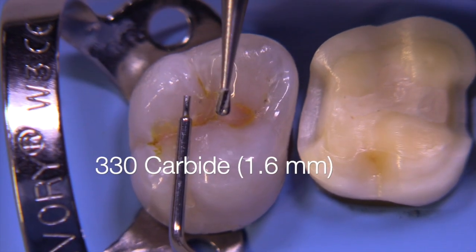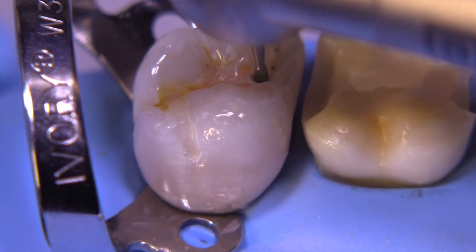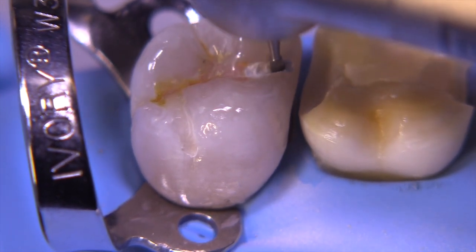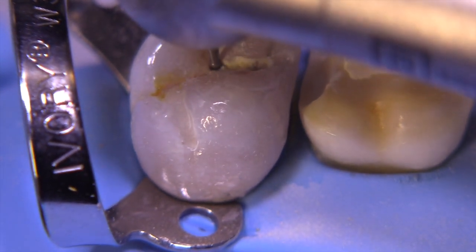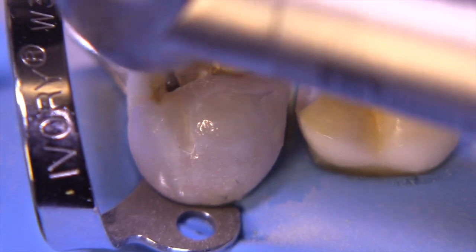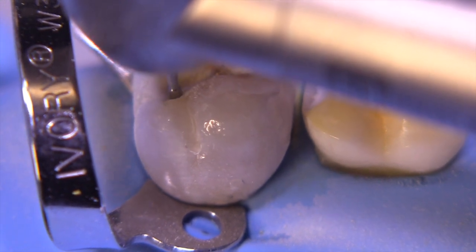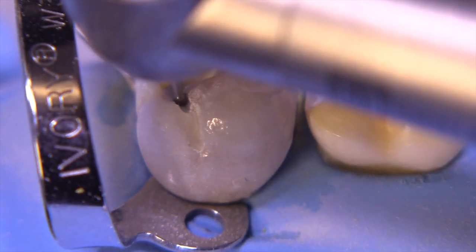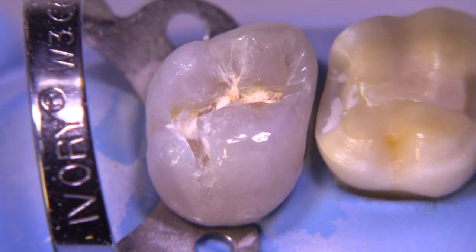We're going to start with a 330 burr to get our initial depth. This is a great way to get a depth cut for ceramics even though it creates convergent walls. It's going to give you the appropriate depth in the center of your restoration so your restoration is not too thin. Don't focus on the walls and how tall they are when finished — focus more on the initial depth cut, then make everything the same depth as the pulpal floor established with the 330 burr.